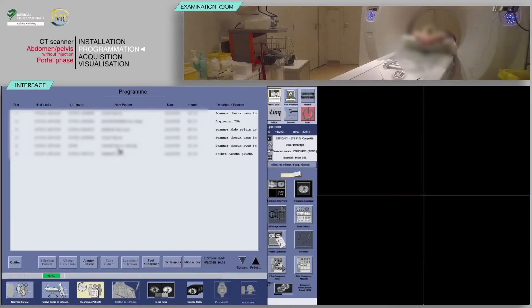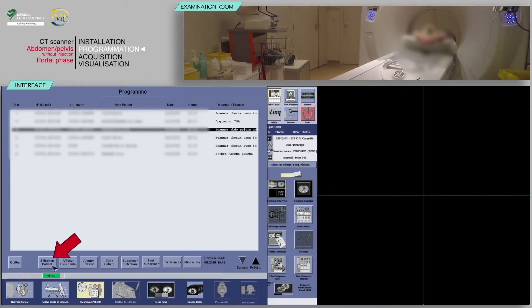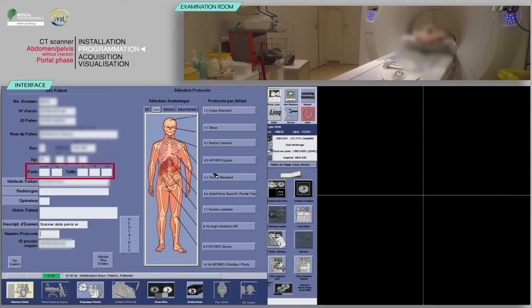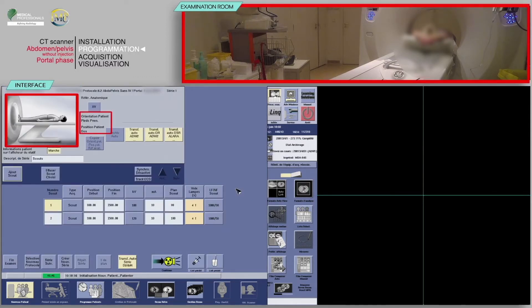Select your patient from the work list and then click patient selection. Verify that the pre-filled information is correct and fill in the patient's weight and height. Finally, choose the appropriate protocol. Check that the patient's position on the table matches with the one indicated.